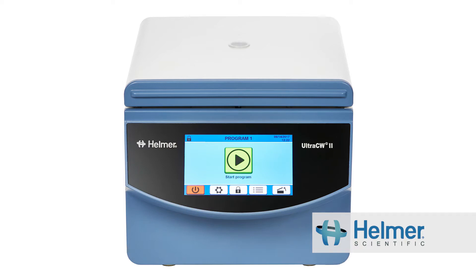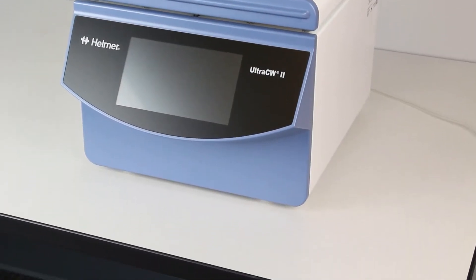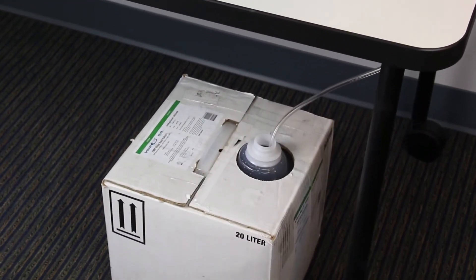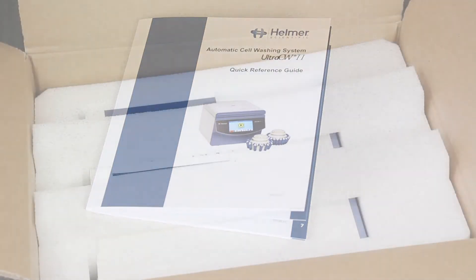This video provides a demonstration of how to unpack and set up the Ultra CW2 Automatic Cell Washing System from Helmer Scientific. The Ultra CW2 is easy to set up, and the saline supply can be placed below or above the unit. A quick reference guide is shipped with each unit to support you in getting started.